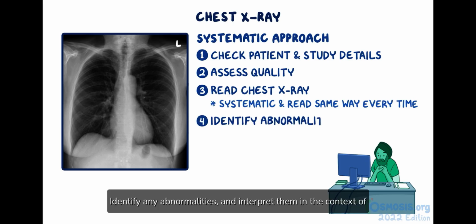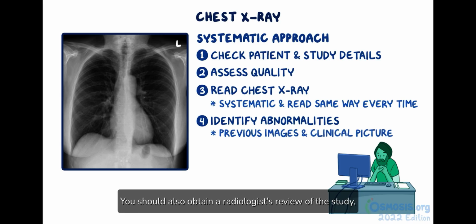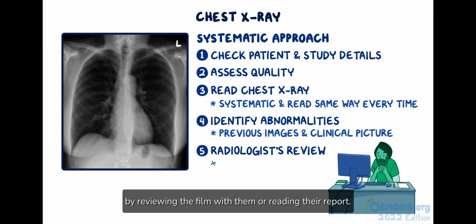Identify any abnormalities and interpret them in the context of the patient's previous images and clinical picture. You should also obtain a radiologist's review of the study by reviewing the film with them or reading their report.